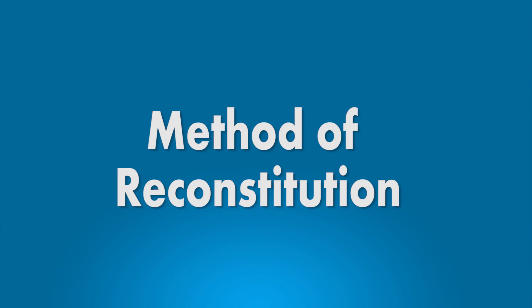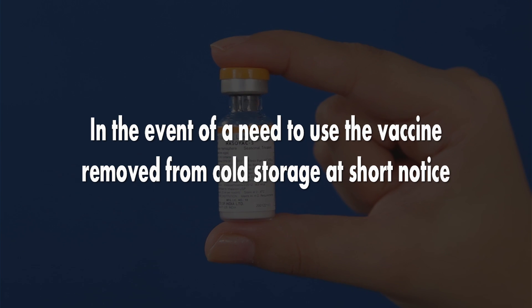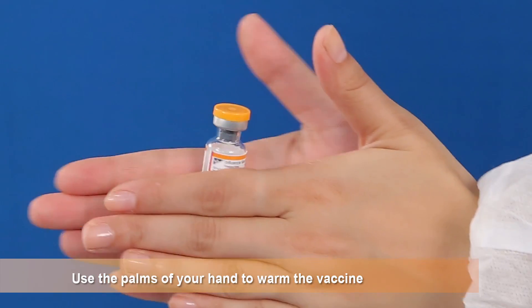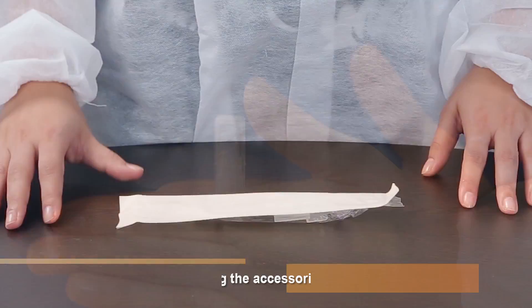Method of Reconstitution: Remove the pack of the vaccine from the cold storage. Allow the vaccine and water to attain room temperature. If cold water is used to reconstitute the vaccine, you may encounter a delay in dissolution. In the event of a need to use the vaccine removed from cold storage at short notice, use the palms of your hands to warm the vaccine and diluent to accelerate the temperature equilibration.